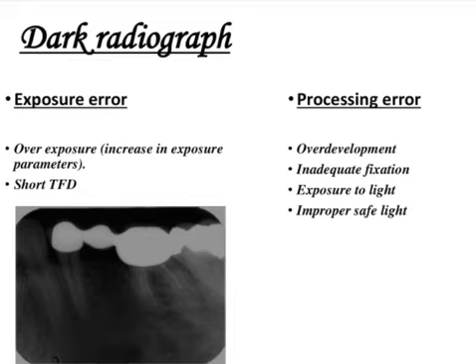That means we want to ensure that there are no light leakage or light leaks inside the dark room. Maybe it can be through a small crack. So if that occurs, you have to seal it with a black tape. Okay, so how do you do a coin test or a penny test?